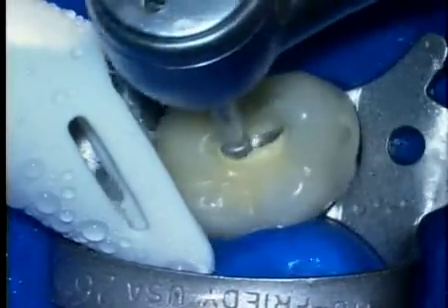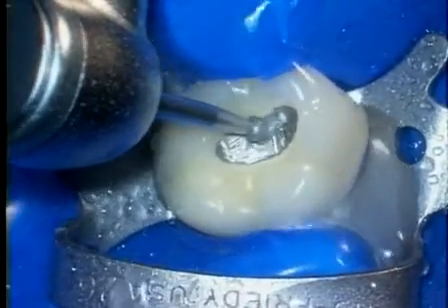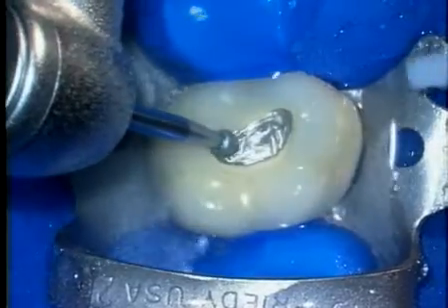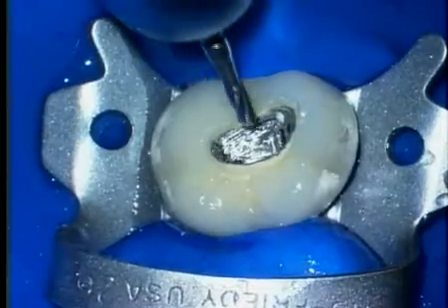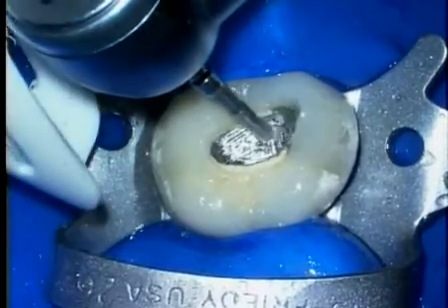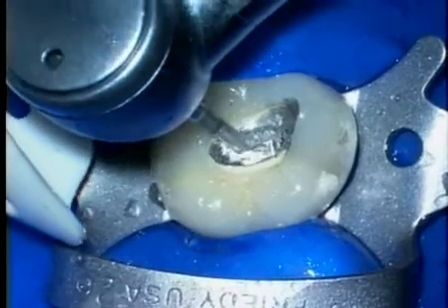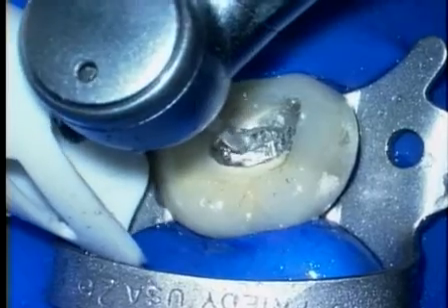Be sure to take your time, don't be in a hurry, and lay the head of the handpiece over towards the mesial. This will give you a line of sight so that you can watch the burr work. Sometimes I like to drag the axial walls up just a little bit more to give me better access and visibility into the chamber.